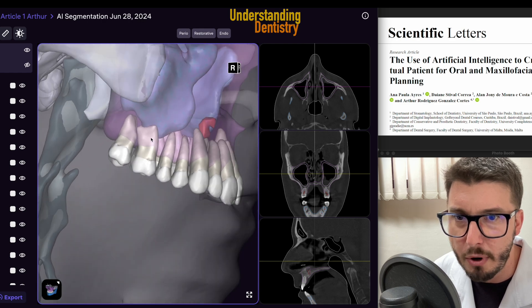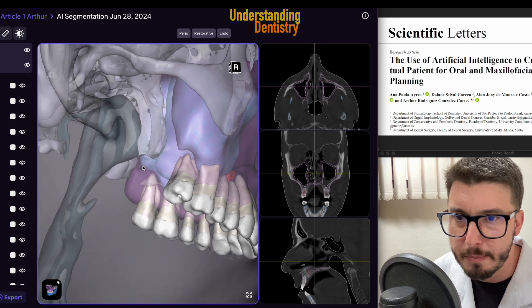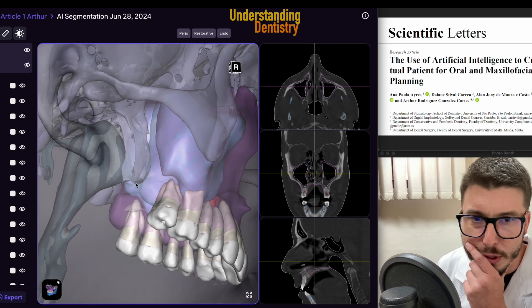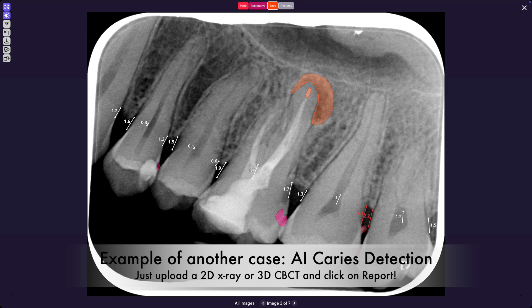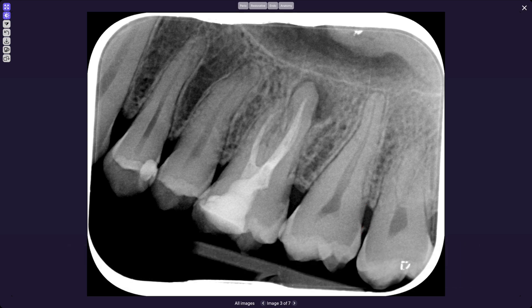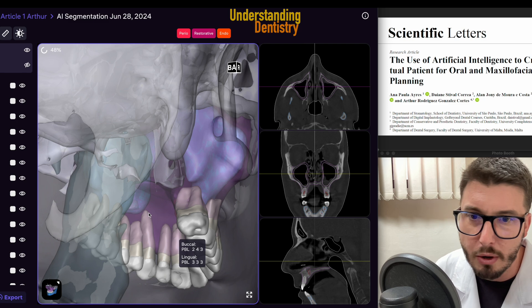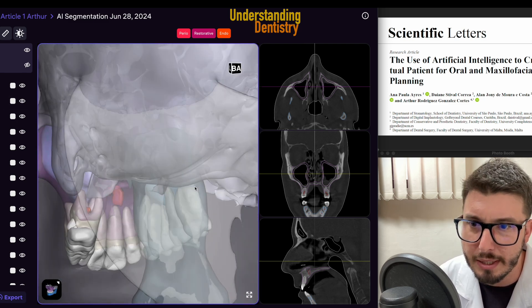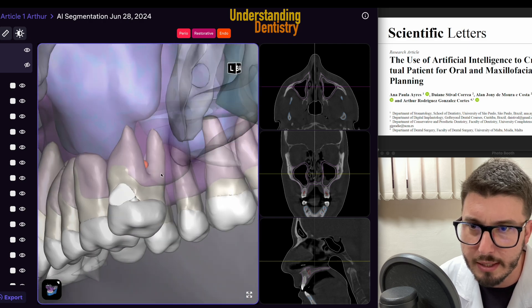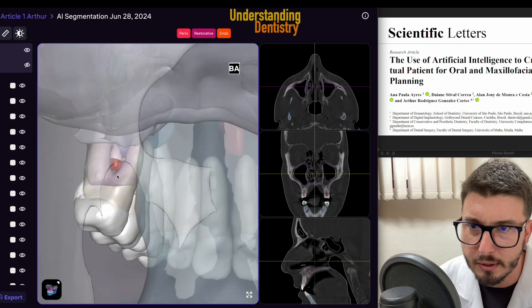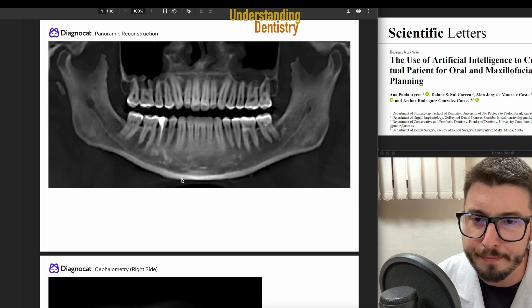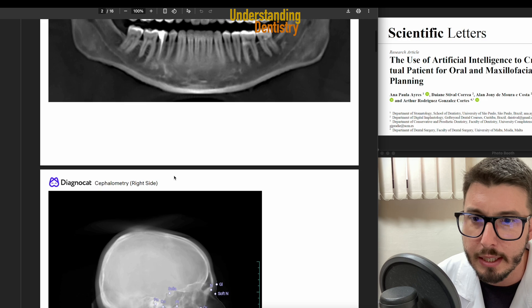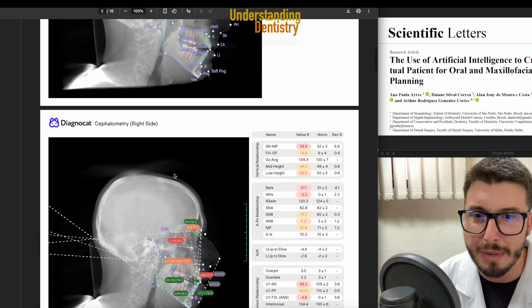We can analyze the shape of the root canals and the shape of the airspace. Let's see now what the software will detect automatically for us — the software will detect alterations, peri-restorative alterations, and a lot of things. This is amazing. The software is now calculating. It's detecting here maybe a furcation exposure.